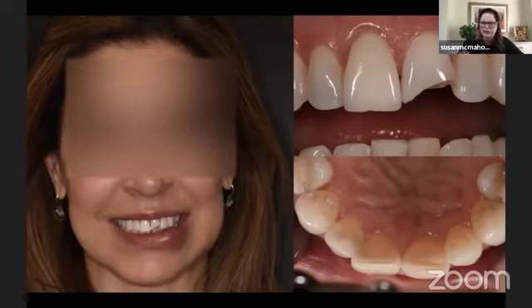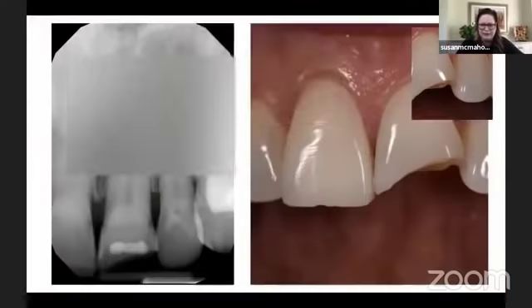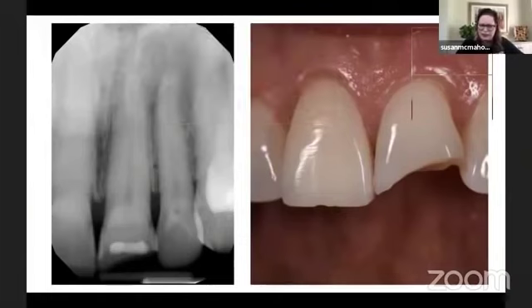So she's got a fracture. You can see underneath there, it's fractured up the lingual pretty well. We take a PA and see that it's nowhere near the nerve, so I know I can restore that, and her root looks intact. We have a CT machine in our office too, and if I was suspecting a root fracture, I would have taken a CT scan, but I didn't need to for her. Look at tooth number 8 next door, the right central incisor. You can see that the whole nerve chamber is obliterated. It's completely calcified down, and that's why it has that whitey opaquey look. I show that to her too and explain it to her.